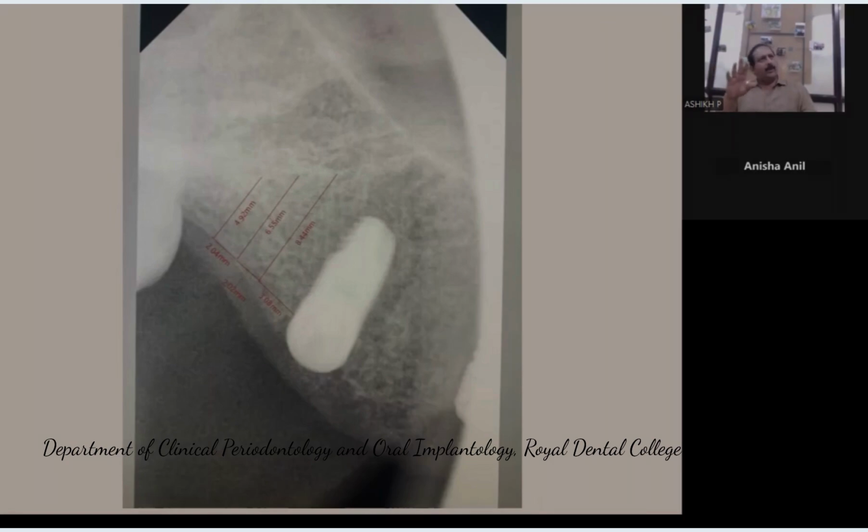Whatever it is, don't go further with your smaller drills. Pilot drill, stop within 6 millimeters. Confirm with your X-ray how many millimeters is still possible. If it is the limit of the drill, which has already reached the sinus floor, then think about sinus floor elevation. That has to be done with the osteotomes and mallets. We'll break the floor. So further preparation should be limited to increasing the diameter within the floor area.